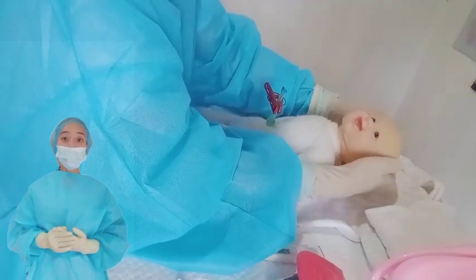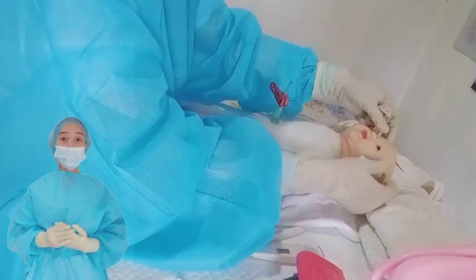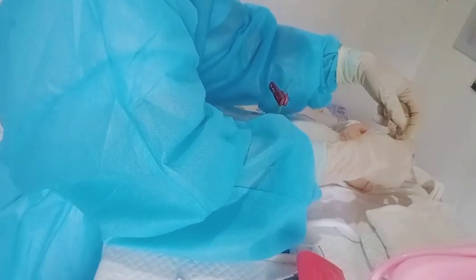Place the tape measure around the head, encircling the forehead over the brow, and the occiput, keeping the baby's body as straight as possible. Head circumference 28 cm.